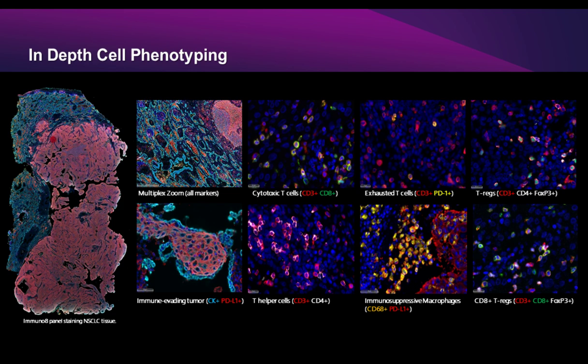Thank you. Can you have artifacts and background signals sometimes? And if so, how do you deal with it? So a quick point I can make on that is, with fluorescent IHC and many regular standard IHC protocols, background issues are always something that pop up. With our assay, we don't actually use any secondary antibodies. So the amount of nonspecific and background signal that you typically see with standard primary, secondary antibody type stains, we eliminate quite a bit of that.